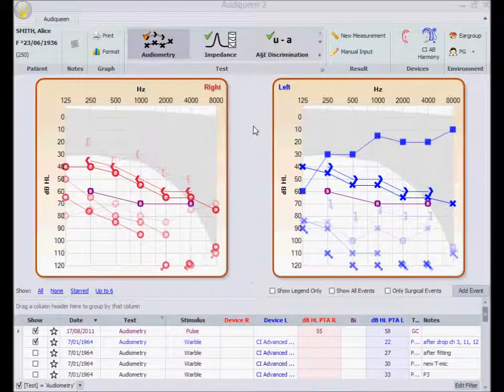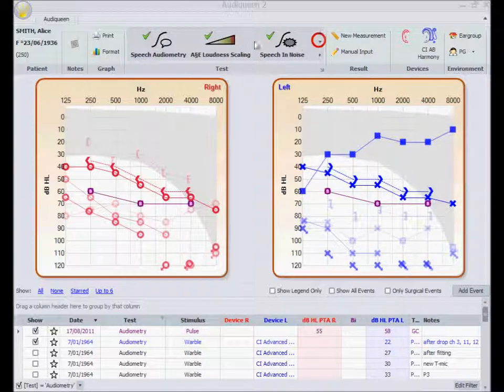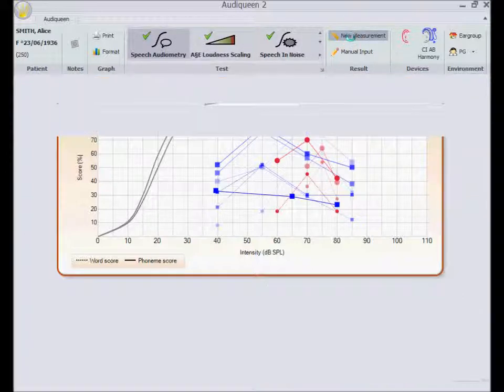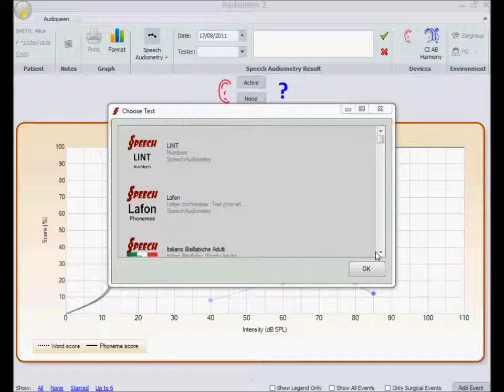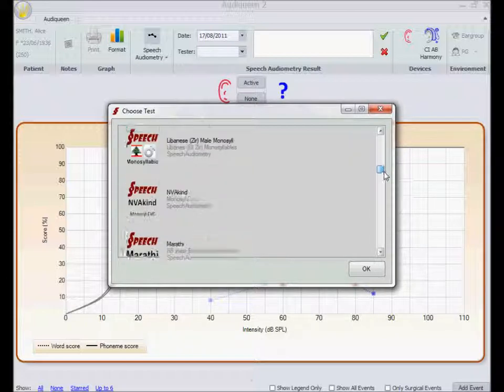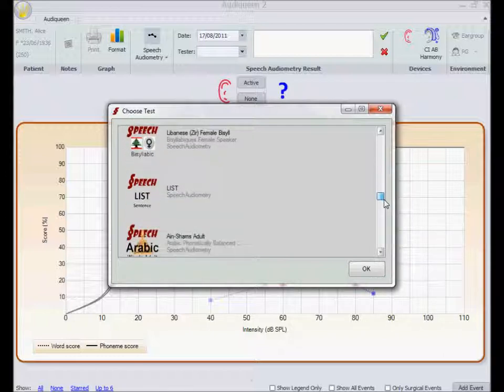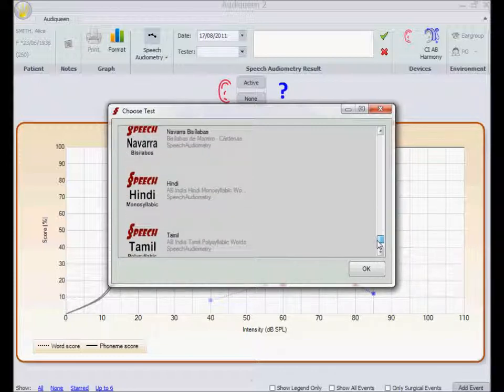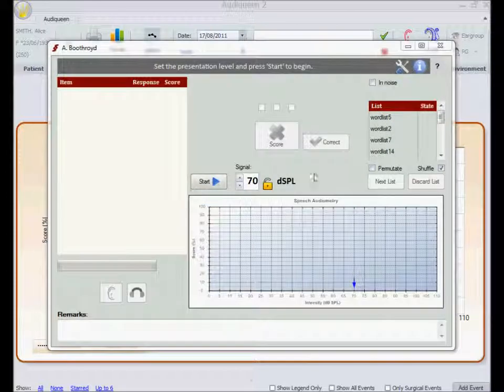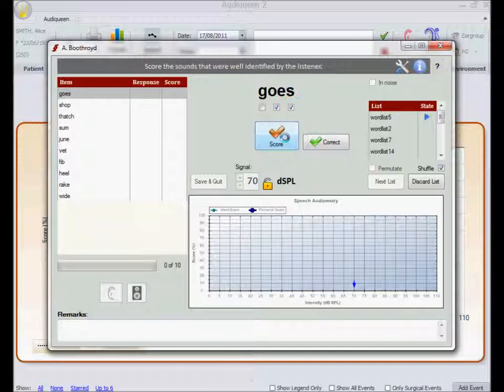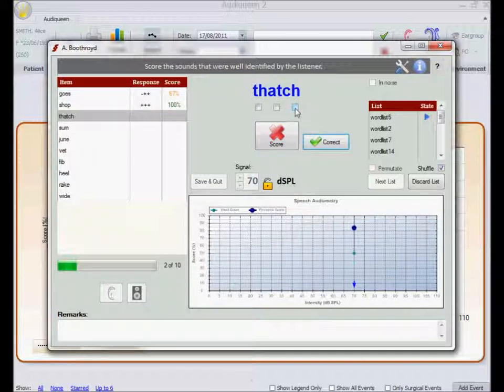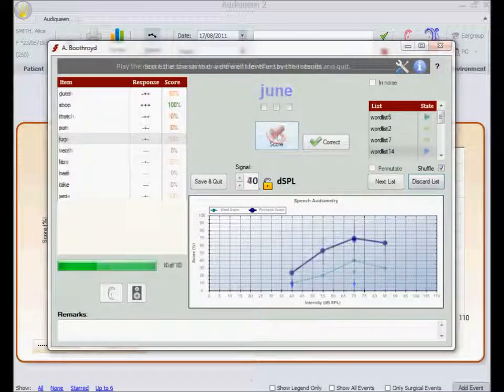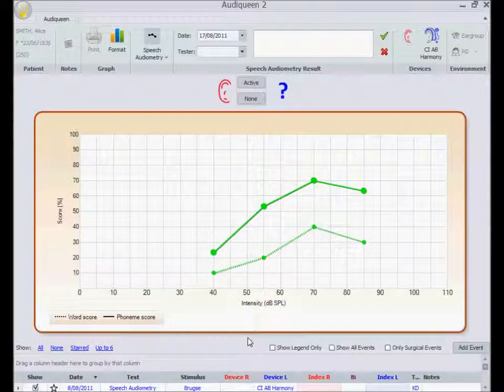The other input method is by using Audiqueen to perform the measurement. Let's take a speech audiogram for this. Audiqueen cannot measure anything on its own. It can connect, however, to another software application to do the job. Our first choice for this is the ACE software. It provides a user-friendly interface which is independent of the audiometers used, and it contains many pre-recorded and calibrated speech lists. More information on ACE is available on Otoconsult's website. After testing, the results appear in Audiqueen where it can be saved.